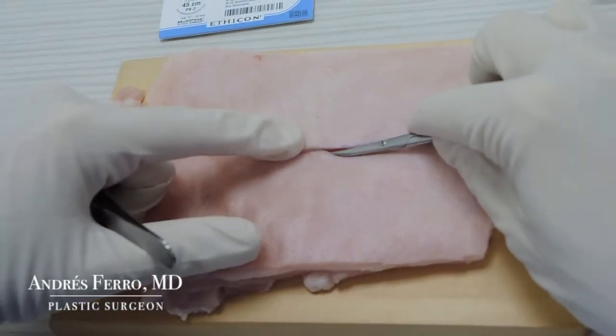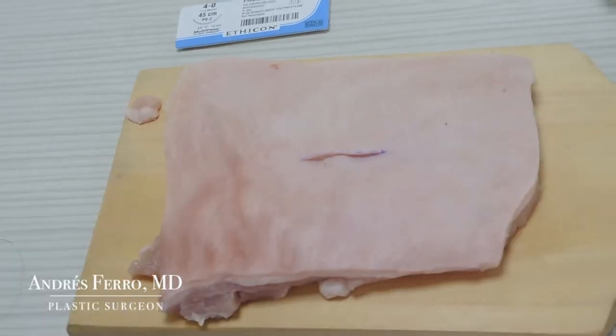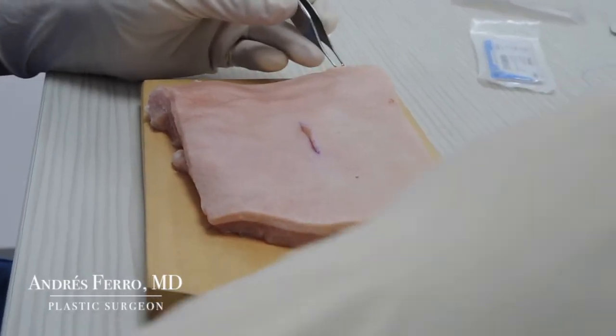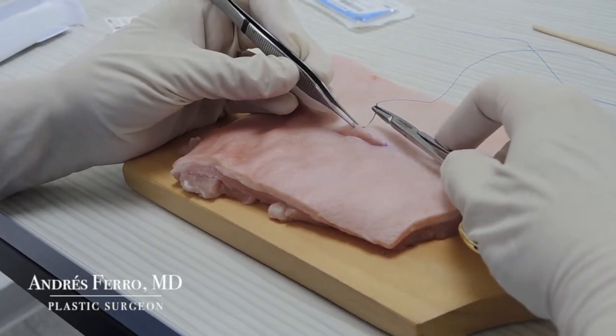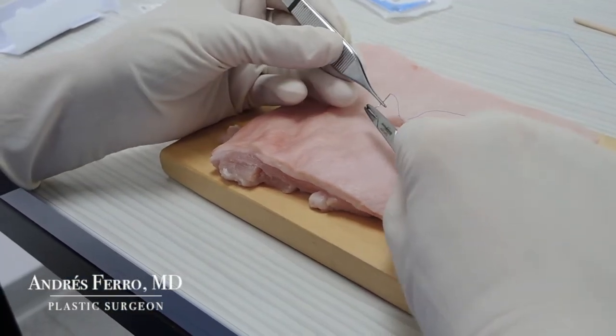Now, we will demonstrate how to correct the asymmetry between the edges of a wound. When correcting this type of wound, we must do a high bite on the highest edge and a low one on the lowest edge. Begin this wound's correction holding with your claw dissection forceps the highest edge at the center of the wound. Introduce the needle through the epidermis and exit through the superficial dermis.